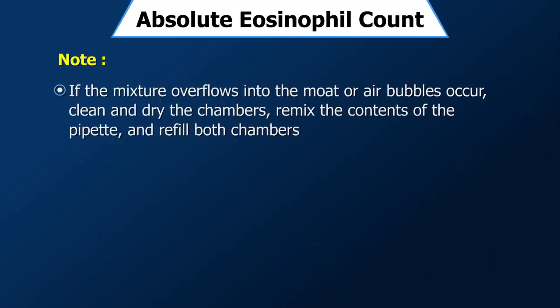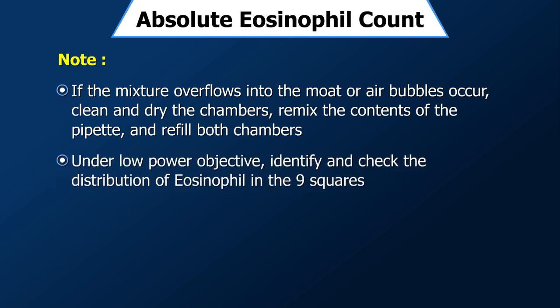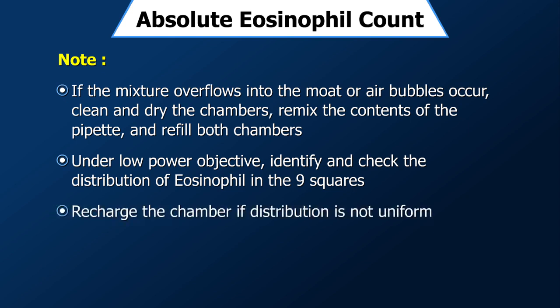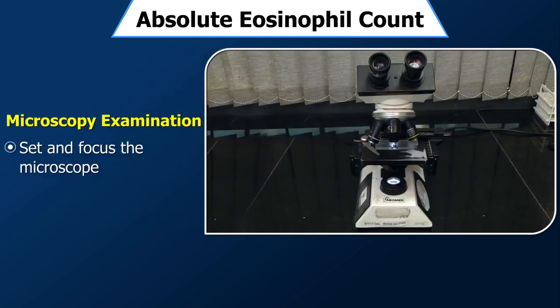Note: if the mixture overflows into the moat or air bubbles occur, clean and dry the chambers, remix the contents of the pipette, and refill both chambers. Under low-power objective, identify and check the distribution of eosinophils in the 9 squares. Recharge the chamber if the distribution is not uniform.